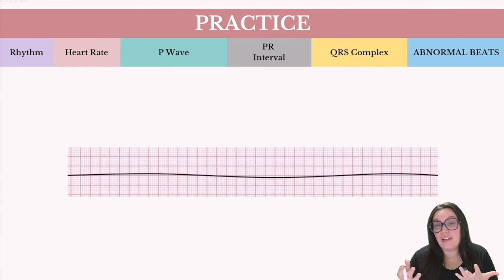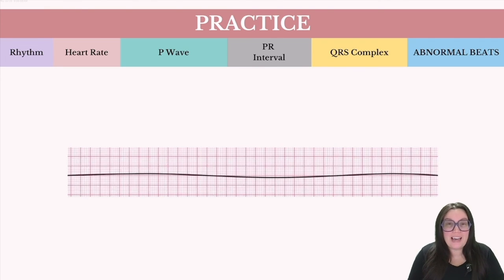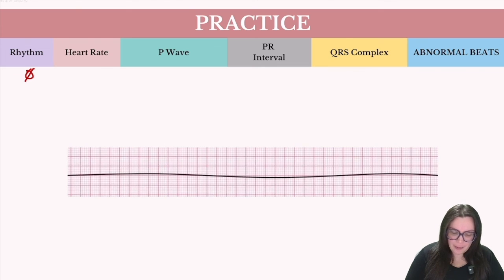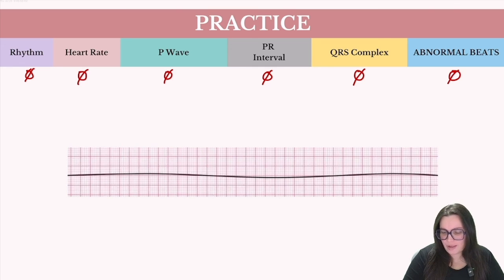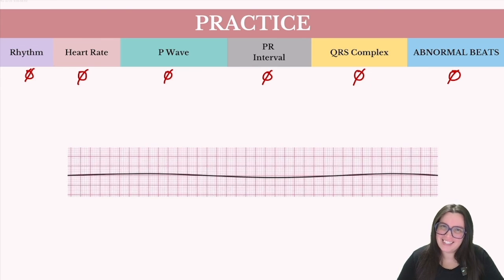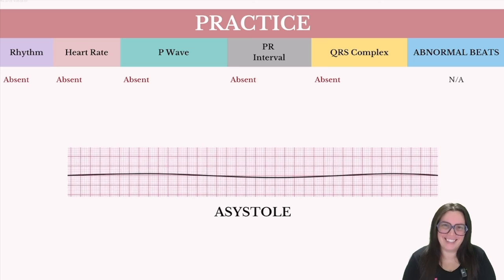Last up — I think this is the easiest identifiable rhythm. Do we have a rhythm here? No. There's no rhythm at all — just this flat line appearance. No heart rate measurable, no P wave activity, no PR interval, and the QRS complex just doesn't exist. It's a completely flat line. What am I dealing with? You guessed it — asystole.